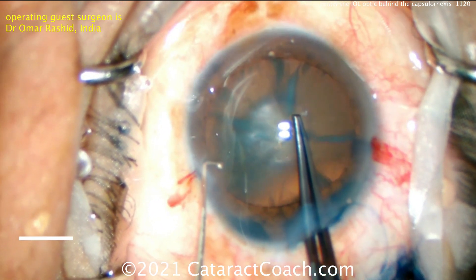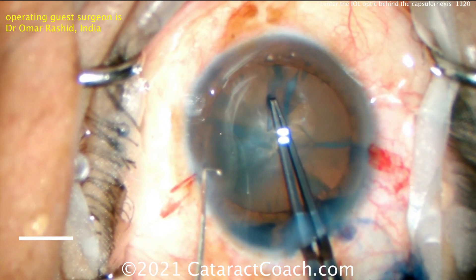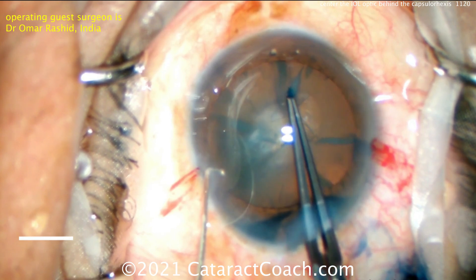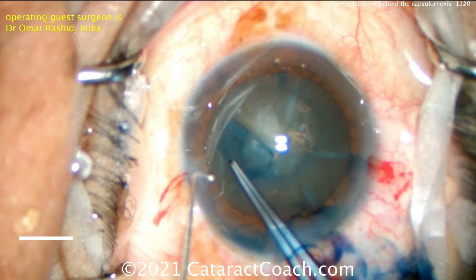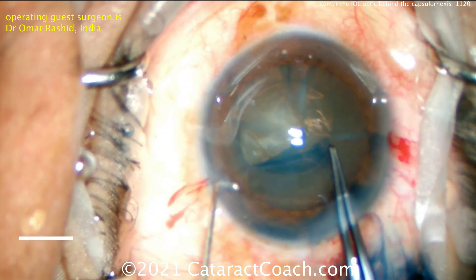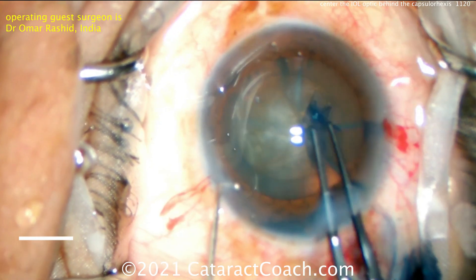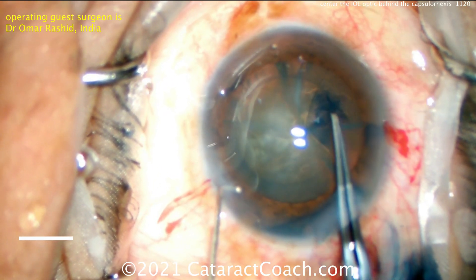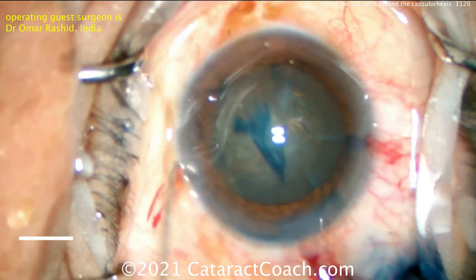Let's see the capsulorhexis technique — just forceps, no cystotome needed. I like that. Pushing here with the tips, getting that flap turned over and making a nice rhexis. Beautiful technique. I like the draping — look at the eyelashes out of the way, the lid margin clean, the eye staying centered in the operating field. Beautiful job. That is a nice looking capsulorrhexis.